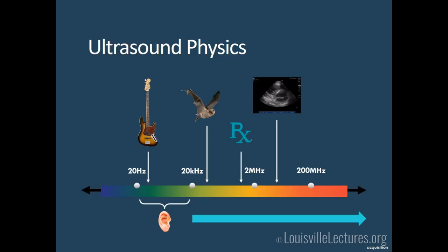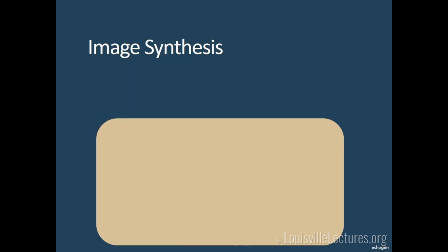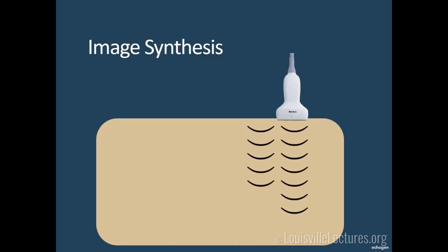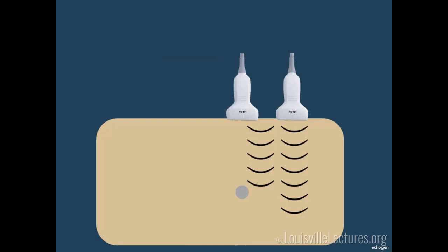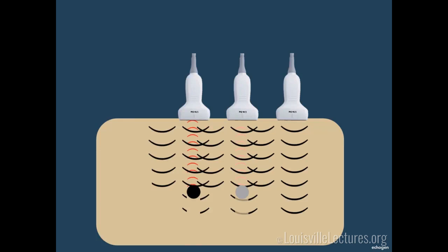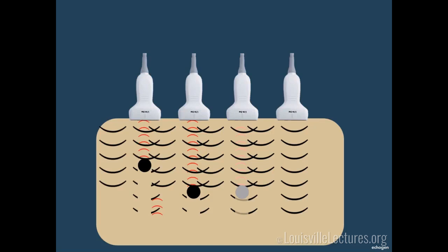It's important to know how images are synthesized on an ultrasound machine. When you put an ultrasound probe on the body, it emits ultrasound waves that can either bounce back or pass through, and are visualized as an image. An object that partially reflects waves gives a gray image. A very solid object reflects all waves and produces a much brighter image. The transducer also calculates distance by measuring how fast those waves bounce back — closer objects bounce back more quickly.